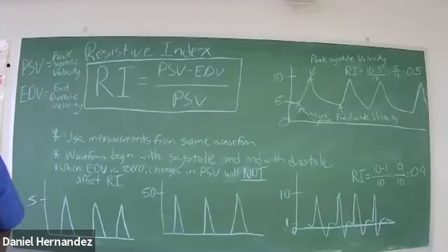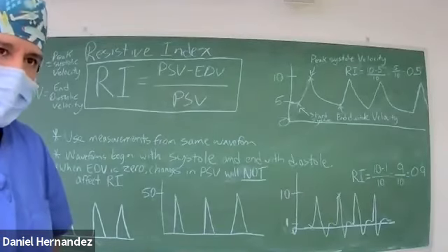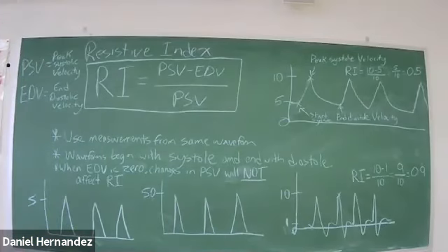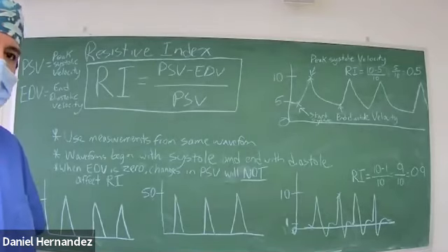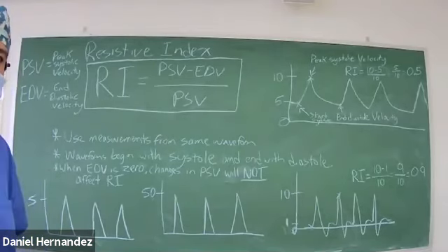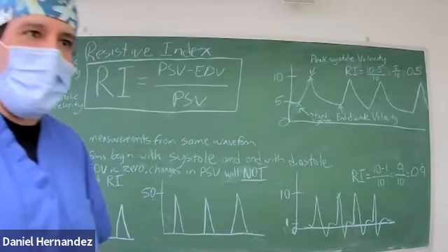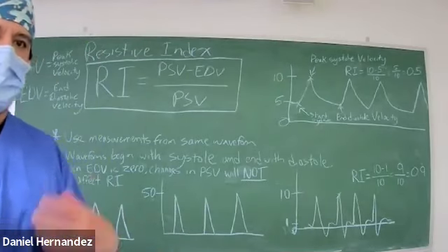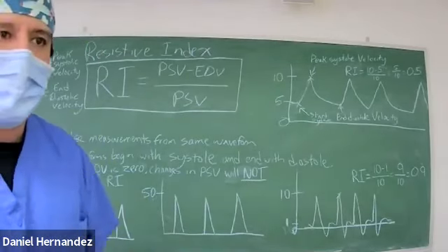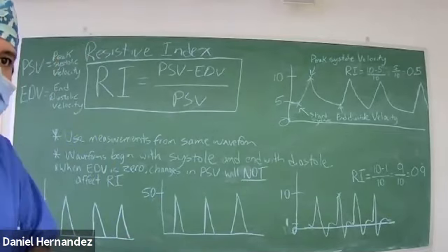It's an important topic, particularly when we're dealing with cerebral vascular circulation and really any artery in general, being able to differentiate between high resistance and low resistant waveforms and what that means in terms of disease processes when we have differences in what would typically be a normal arterial waveform for that particular organ or body segment that we're imaging.